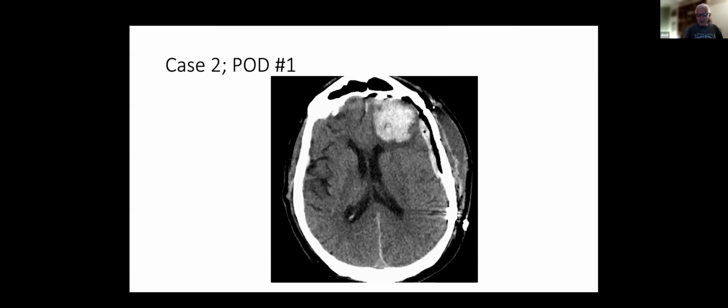Okay, that was my comment. There's a couple of good comments also on the chat. So you get asking, there's a pre-op Dyna CT, there's a previous craniotomy. Do we know what it looked like, was there a sort of bony defect there? Yeah, so the patient was initially taken on call for evacuation of the subdural, and then was retaken for surgical ligation. That's why there's a bony defect on the initial.